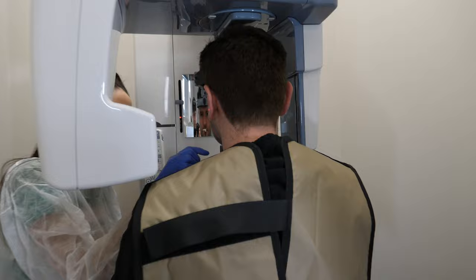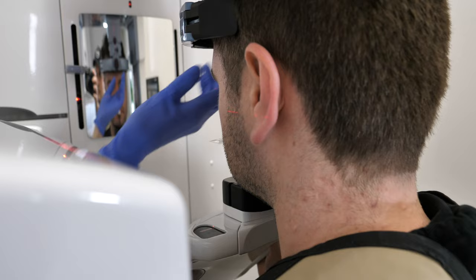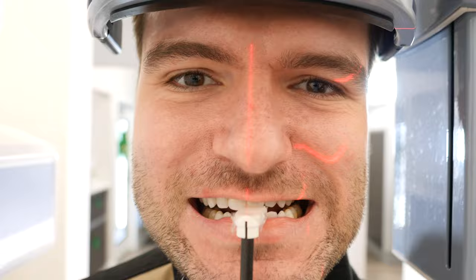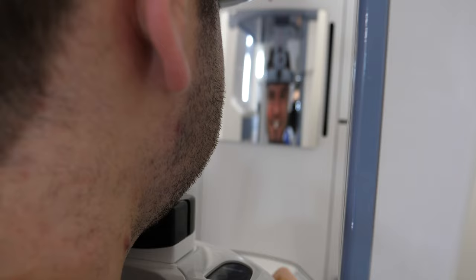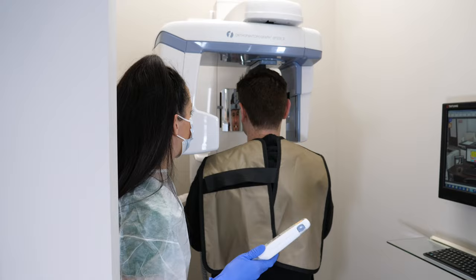The dental provider will adjust where the lights need to be positioned relative to your face. Usually there is a light that goes straight in the middle of your face — you can sometimes see yourself if there's a mirror in front of you. There are also sometimes lights on the sides to line up with specific structures in your mouth. They will walk you through this; you don't need to know anything or prepare anything beforehand. It's a step-by-step thing and they will let you know what to do for each step.